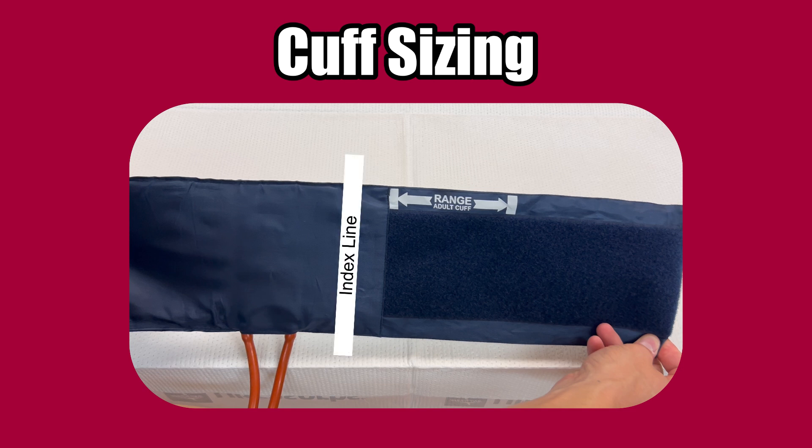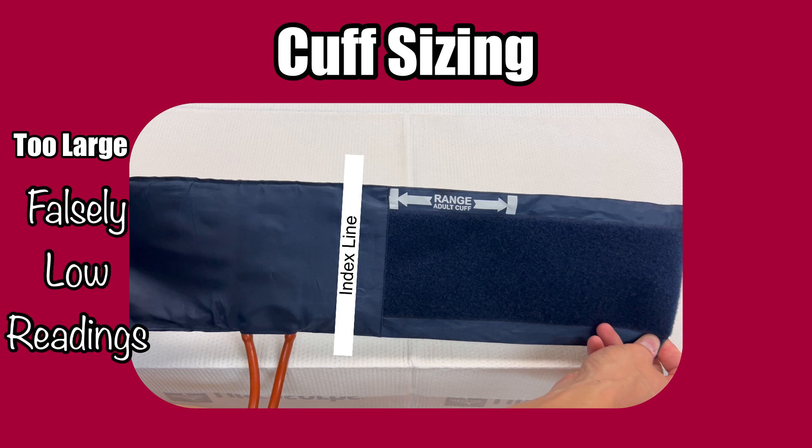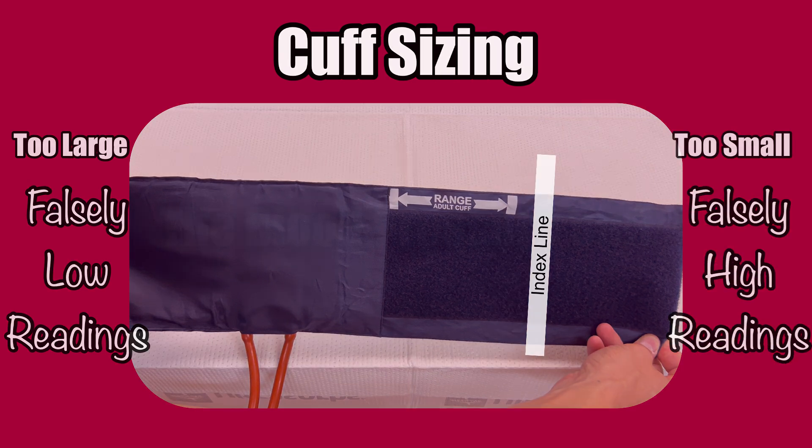If the index line attaches before the range starts, the cuff is too big. Performing a manual blood pressure using a cuff that is too big will result in artificially low blood pressure readings. If the index line attaches after the range markers, the cuff is too small. Small cuffs result in artificially high blood pressure readings.